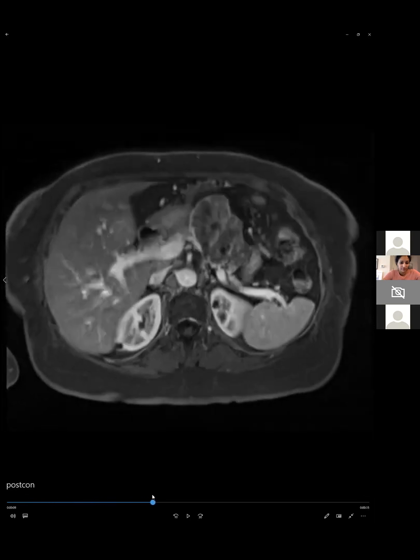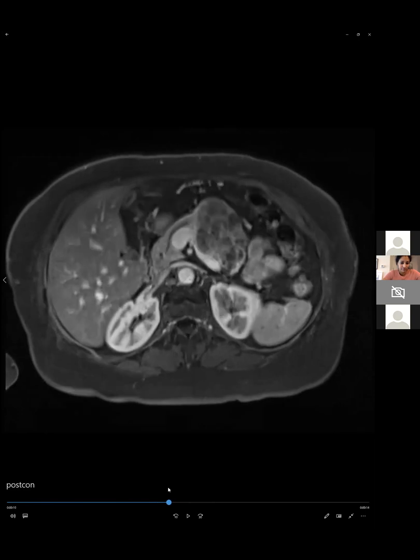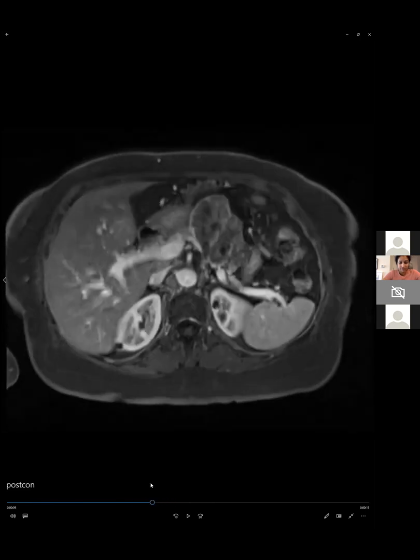So we've had a few of these that look like this, very bright on the heavily T2 weighted images. They look like they have enhancement sometimes, as you're showing there, and then they actually go to EUS after the fact because we weren't sure, and they've ended up just being these serous adenomas, and we followed them on imaging over time, and they've been stable. And I think that image right there shows the nice septations emanating from the central scar. Often if you can't see the cysts that well, but you see more enhancement there, that's because the cysts are so small that you're mostly seeing the very vascular enhancing septae.